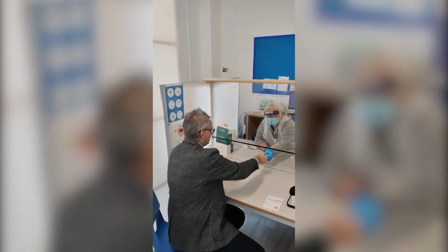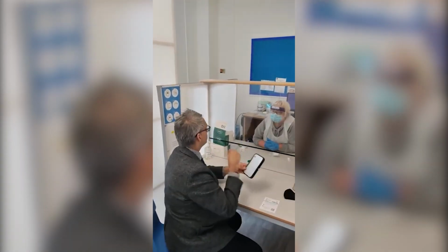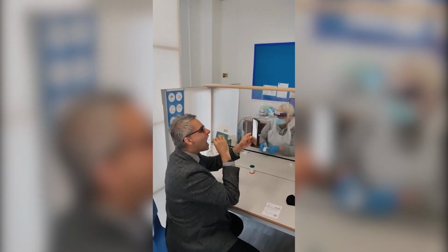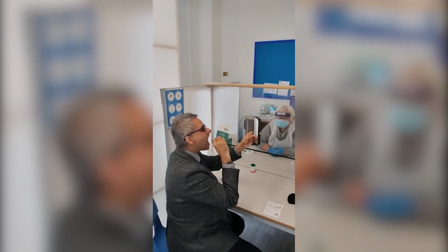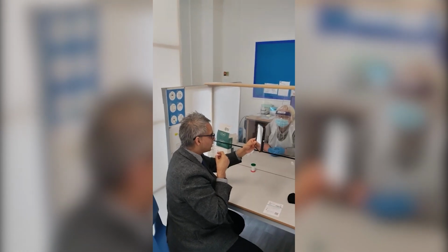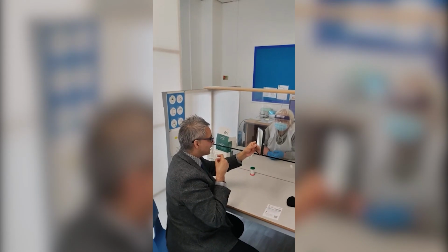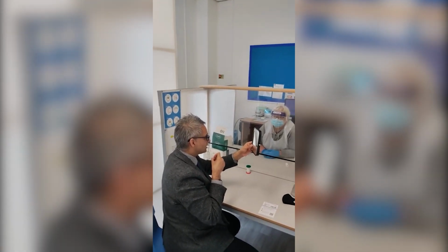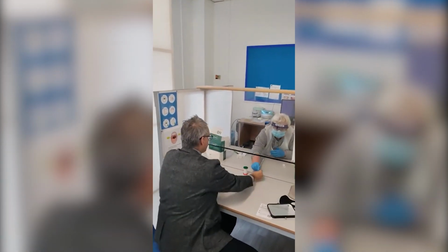That means it's just coming out of its vacuum packet. And then 5 times on one tonsil, 5 times on the other, 10 times up the nose. Go, and then just 1, 2, 3, 4, 5, 6, 7, 8, 9, 10. There we go. I'll hand that back to you.